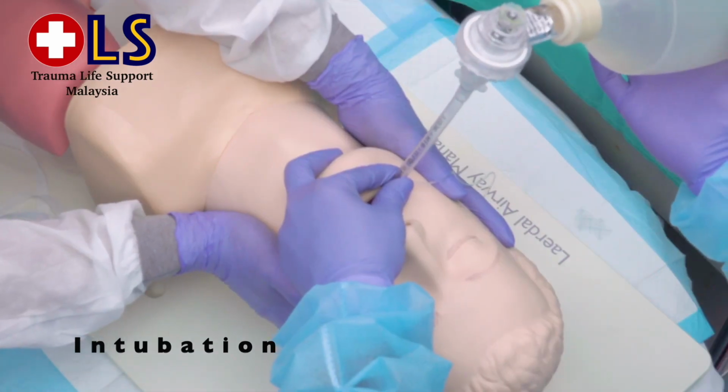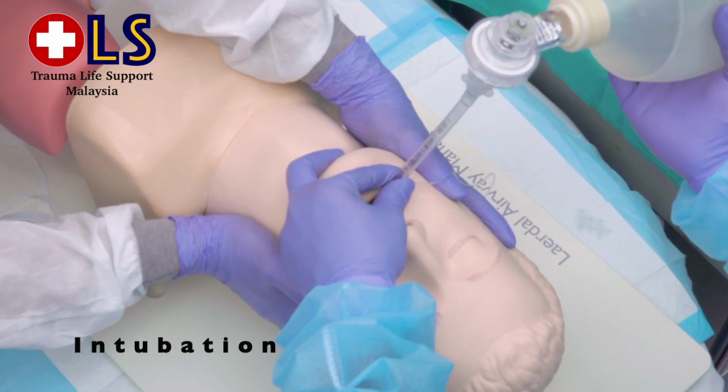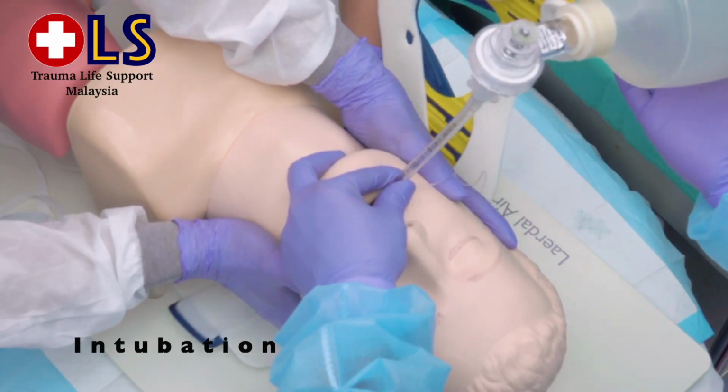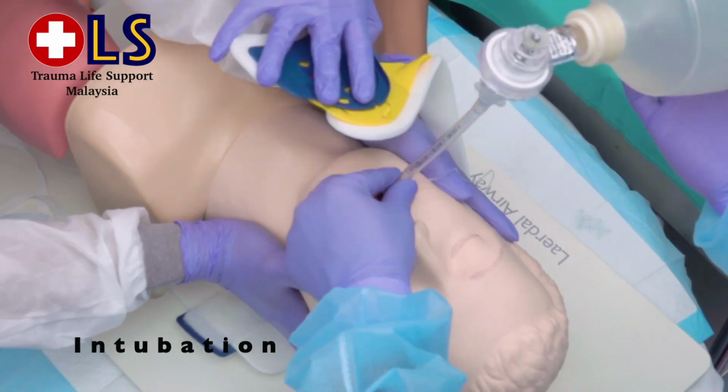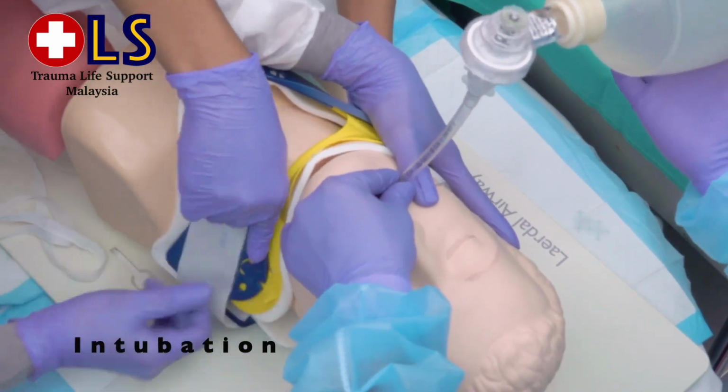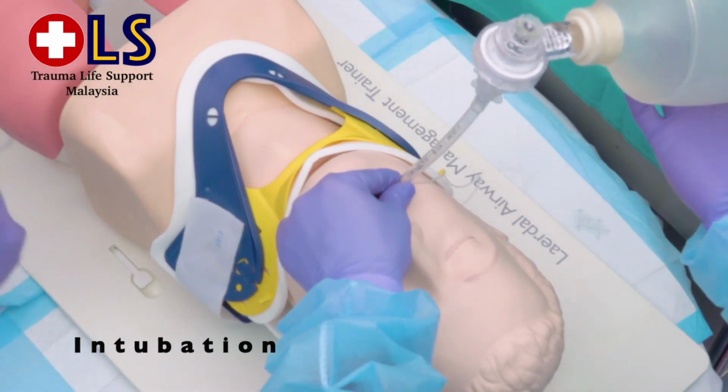Once the patient is intubated, reapply back the cervical collar. Ensure inline immobilization is always done. Then secure your ETT tube.